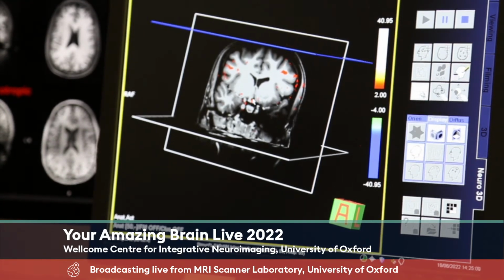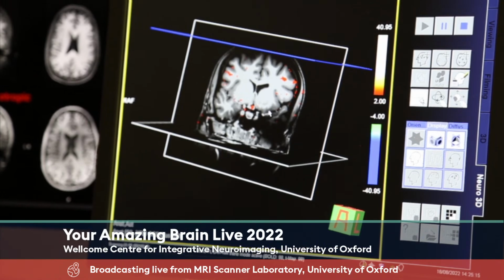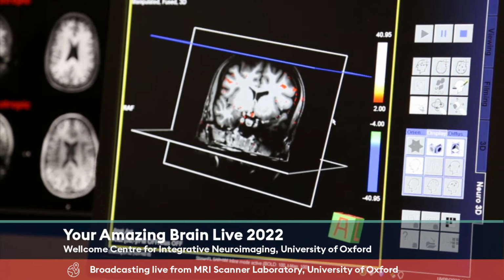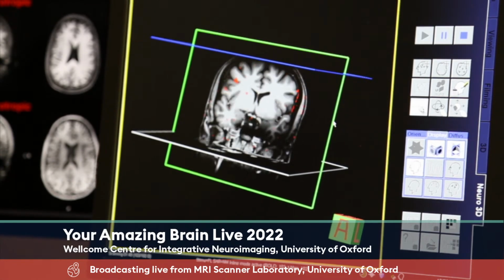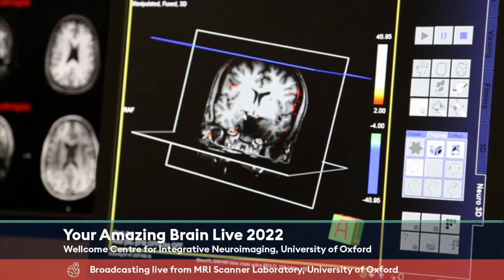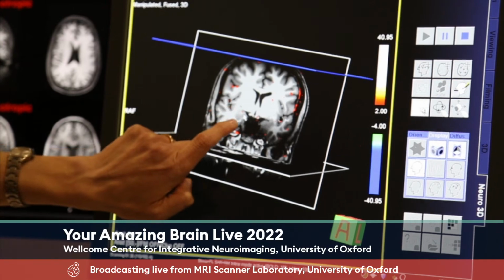It's one of those neurotransmitters that lots of people think about, one of those brain chemicals that lots of people think about when they think about reward. And so you can see actually this activation wasn't there earlier, but it is now coming up when Barbara is looking at kittens, which is really intriguing. And you can see there's a really old structure here, which you can see in gray, both here on the left, I'll just show it with my finger, and here on the right, and you might have come across it.